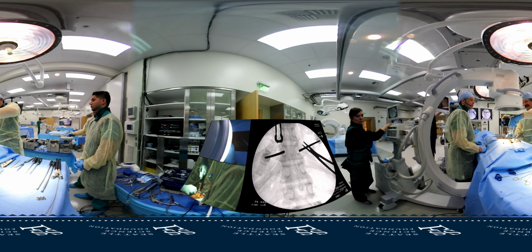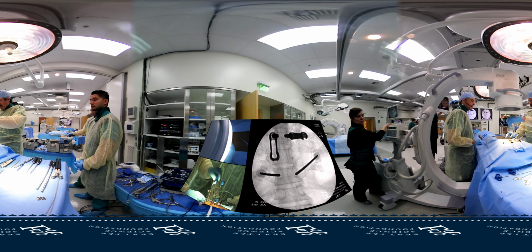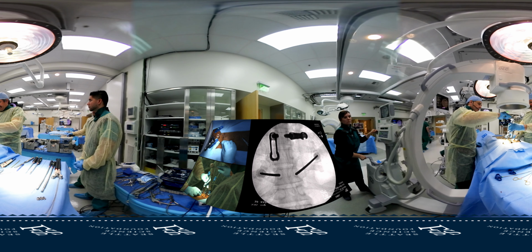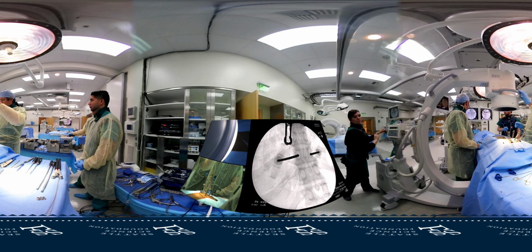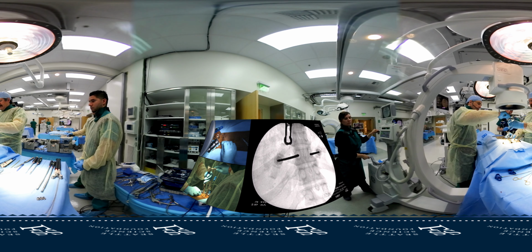All right. Okay, picture there. All right, so I'm going to hold it up. I'm not going to go as medial. Go ahead, go north, and we'll tap it in a little. Good. Come down and show it to me. So what I did is I didn't converge as much. Okay, so see I'm still there, and go ahead, tap it in a little further. I've not crossed the midpoint.